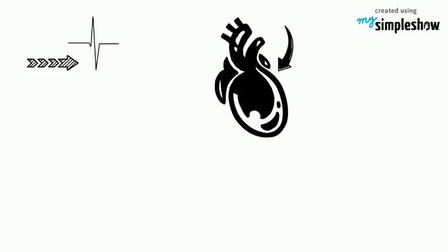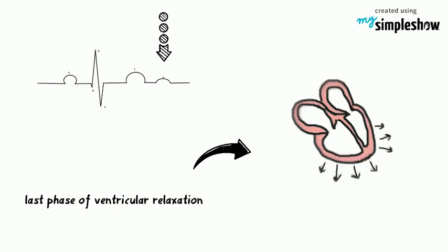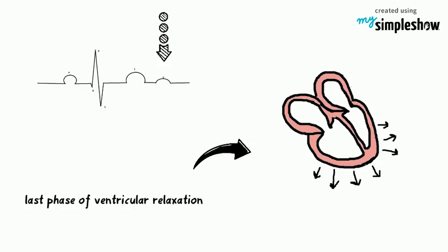The T wave represents the ventricular repolarization. Its normal duration is 0.27 seconds and amplitude is 0.15 to 0.5 mV. The U wave is the final wave in the ECG. U waves are thought to represent the repolarization of the Purkinje fibers. The U wave represents the last phase of ventricular repolarization.